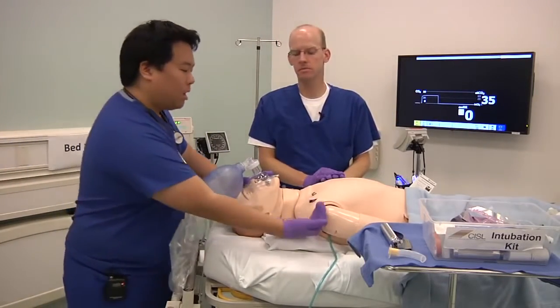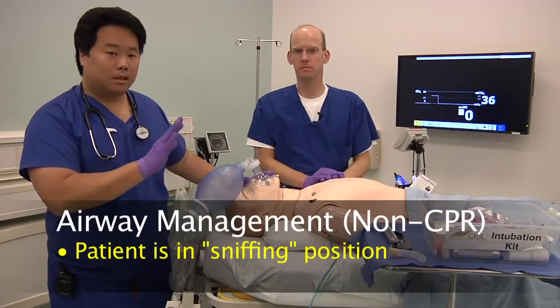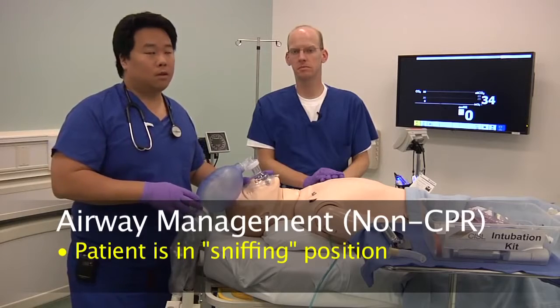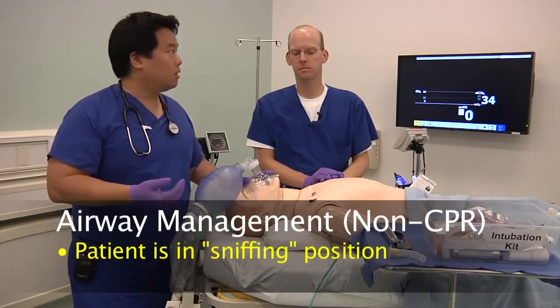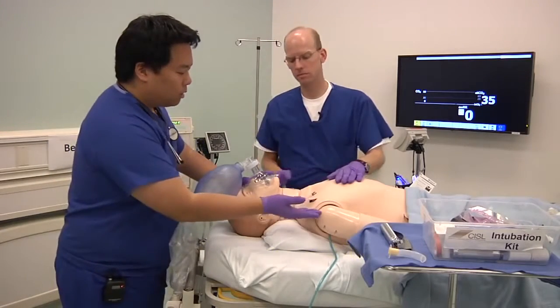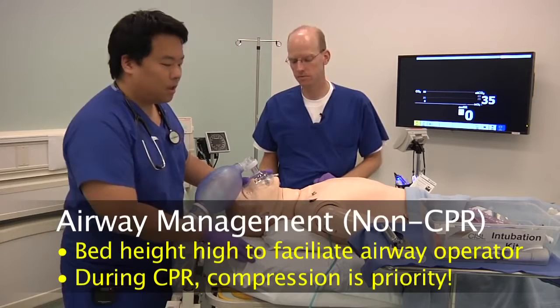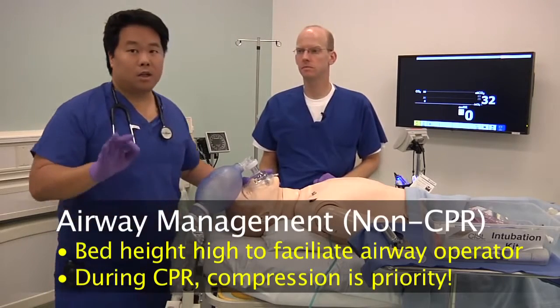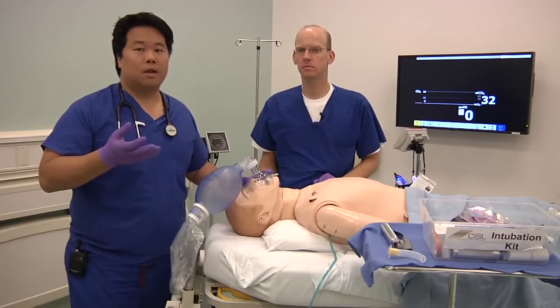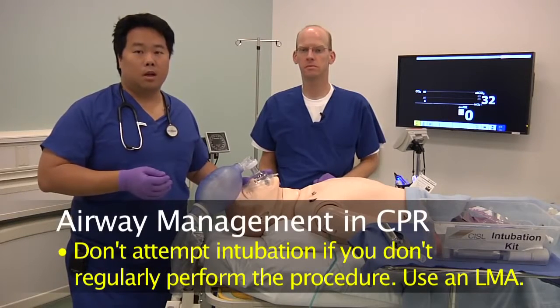The other thing is you'll notice that the patient is positioned much more towards the head of the bed in this non-arrest situation, which you might find, for instance, in an elective intubation in the ICU, where the patient is not in arrest, is hemodynamically stable, but requires intubation for some reason. Also, you'll notice that the patient is in a sniffing position, the flexion and extension of the neck to facilitate endotracheal intubation. Now, I'm not actually going to take you through all the steps of endotracheal intubation because what we know is that if you don't regularly perform endotracheal intubation, you shouldn't be doing it in a code situation.